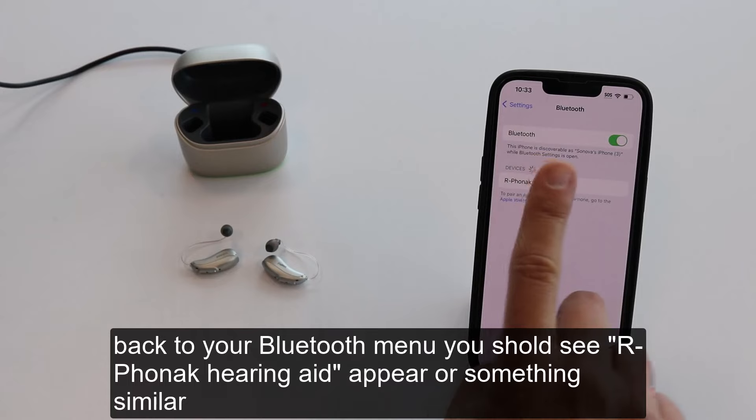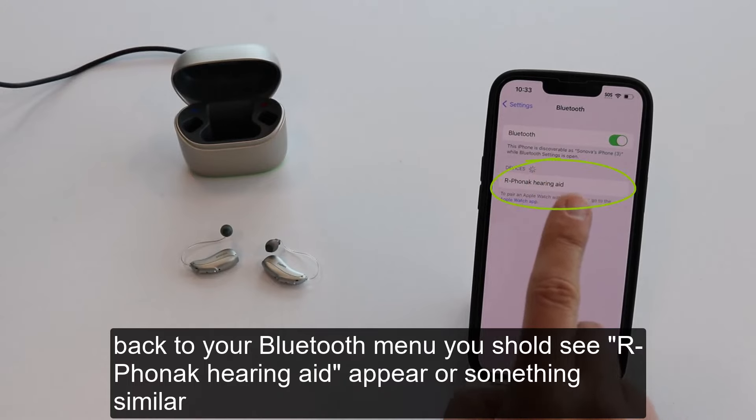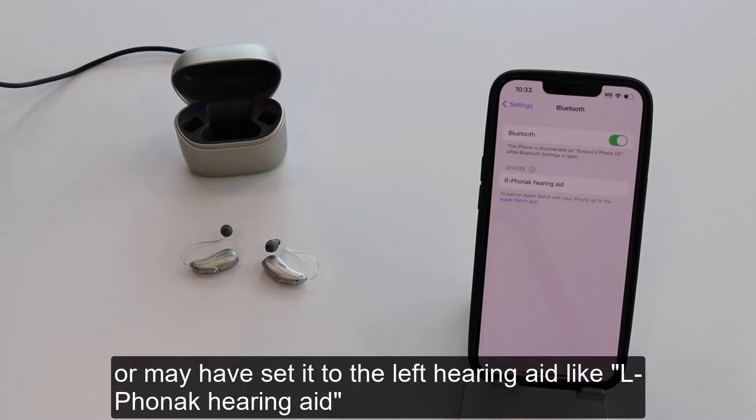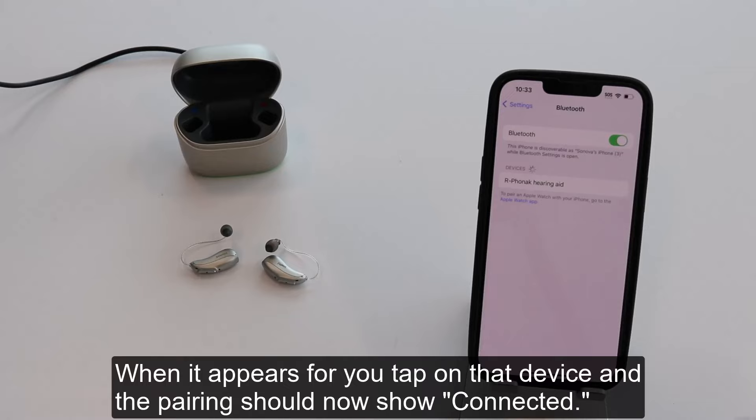Back in your Bluetooth menu, you should see R-Phonak Hearing Aid appear, or something similar. It is possible your hearing care provider renamed your hearing aid to something else, or may have set it to the left ear like L-Phonak Hearing Aid. When it appears, tap on that device and the pairing should now show connected.